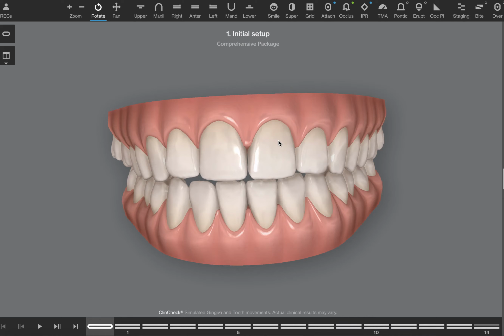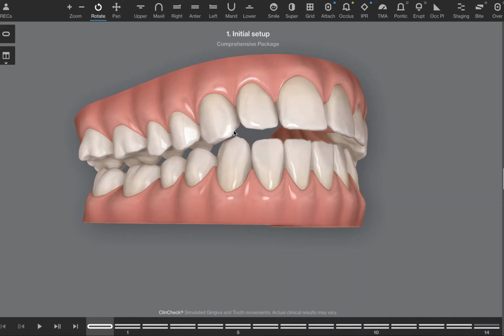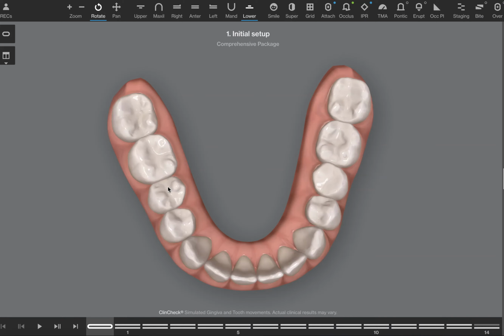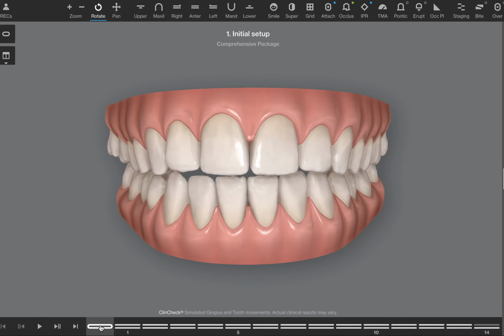Like we talked about on the phone yesterday, I could bring all of these teeth in to match the lower arch, but that decreases the size of the garage for the tongue. We'll call that the palatal vault. Instead, what I'd like to do is expand the lower teeth. So take these teeth and move them out, and by doing that, allowing the back teeth to come together better so that your front teeth will come together. So let's take a look at what Invisalign has proposed.